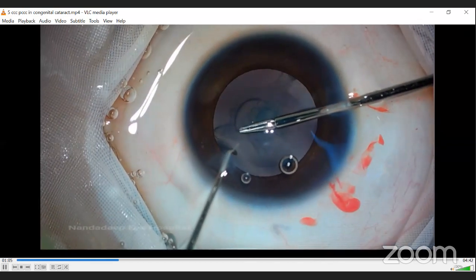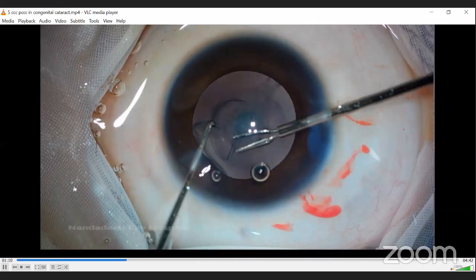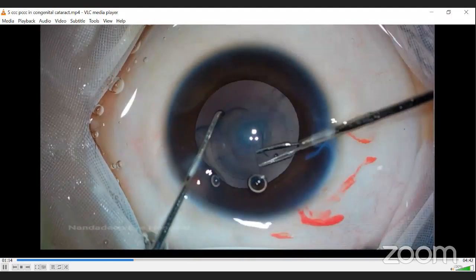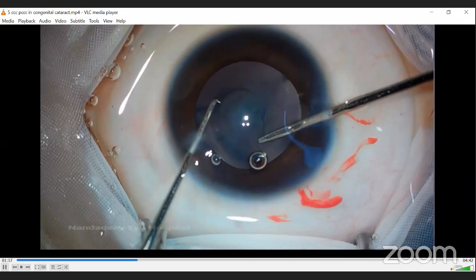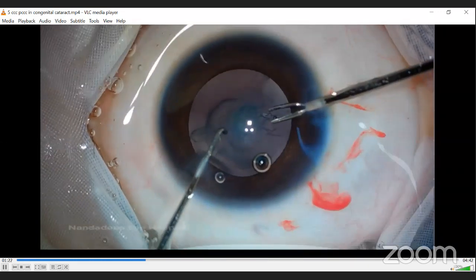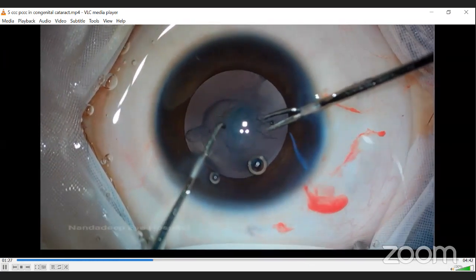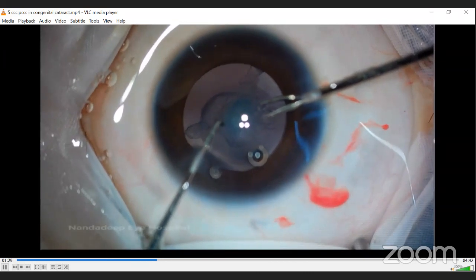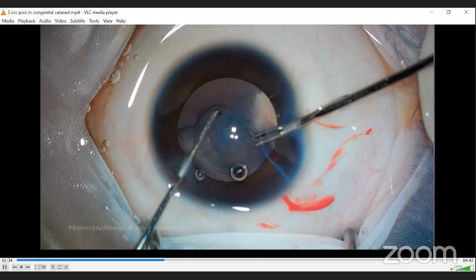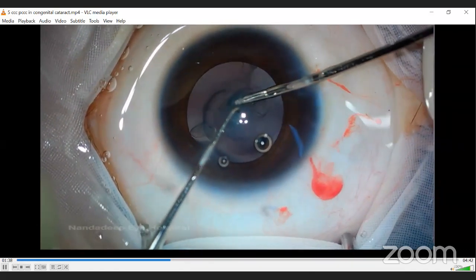Again, watch here how I'm doing. So as far as possible, we have to keep pulling it centripetally. If you try to pull even a little bit tangentially, that means using shearing kind of force, you will find the rhexis is going outward. That is because the zonules are quite strong and elastic, and they tend to pull this torn edge outside. So you have to keep on using the tearing force here.